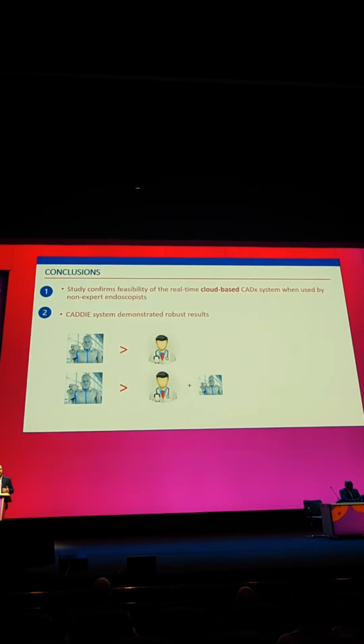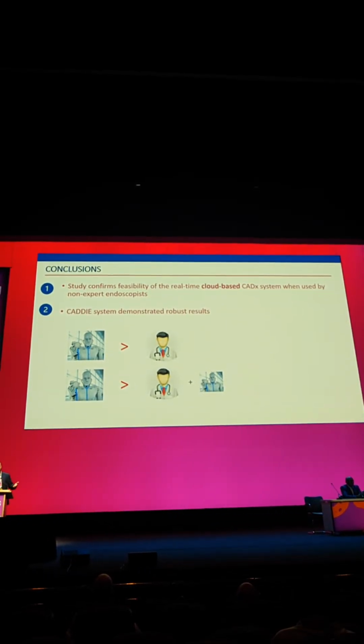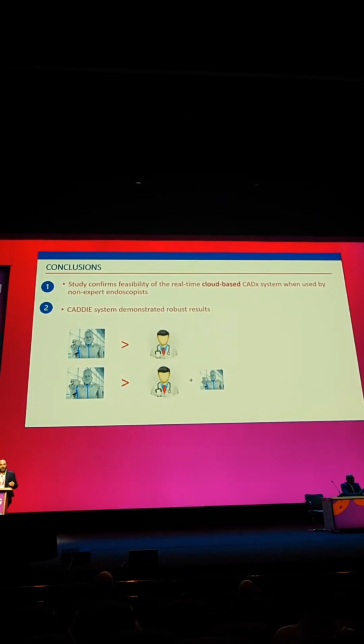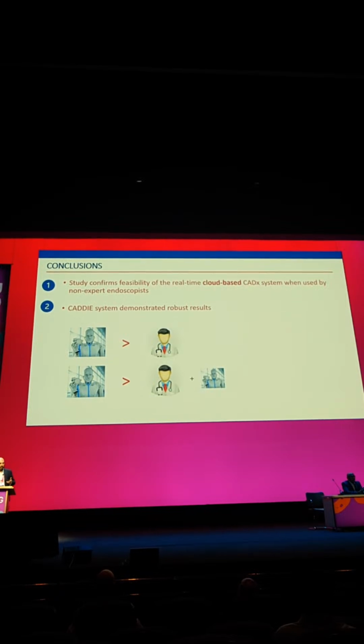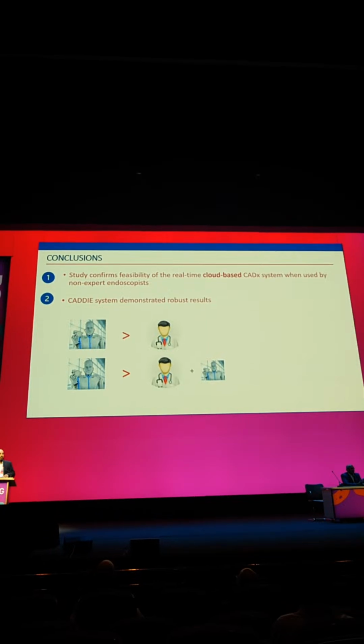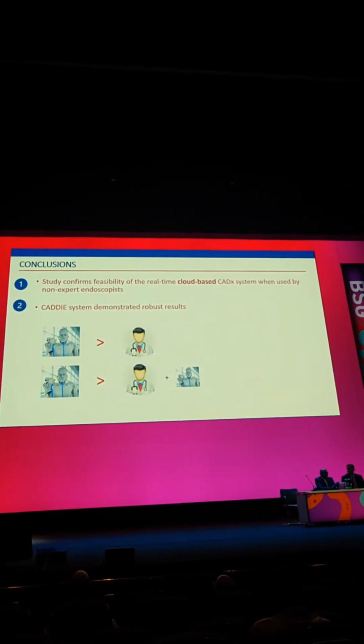But what's slightly surprising is when you give these non-expert endoscopists the CADx answer, the end result is humans actually lower the end performance. And what this really alludes to is a really important point, which is the human-computer interaction with CADx is clearly much more complicated than, say, it is for computer-aided detection of polyps.